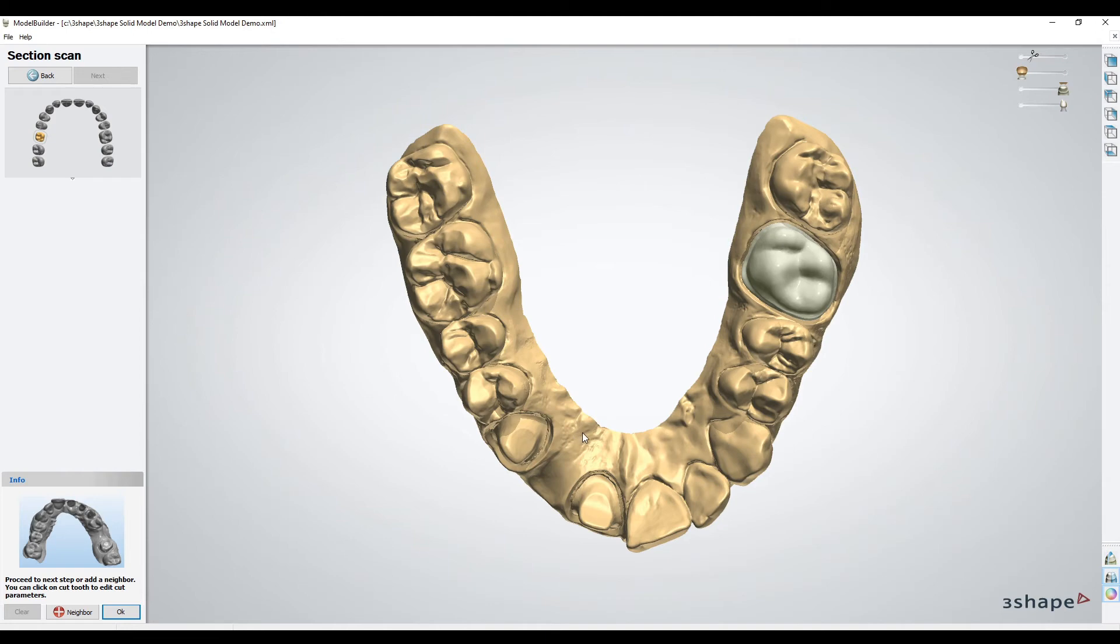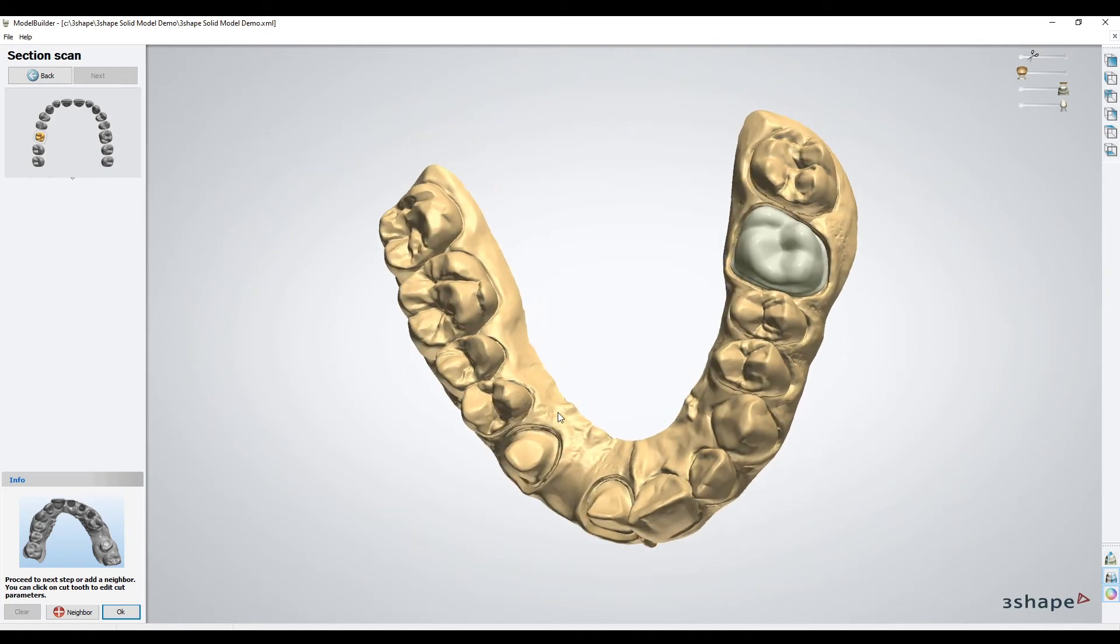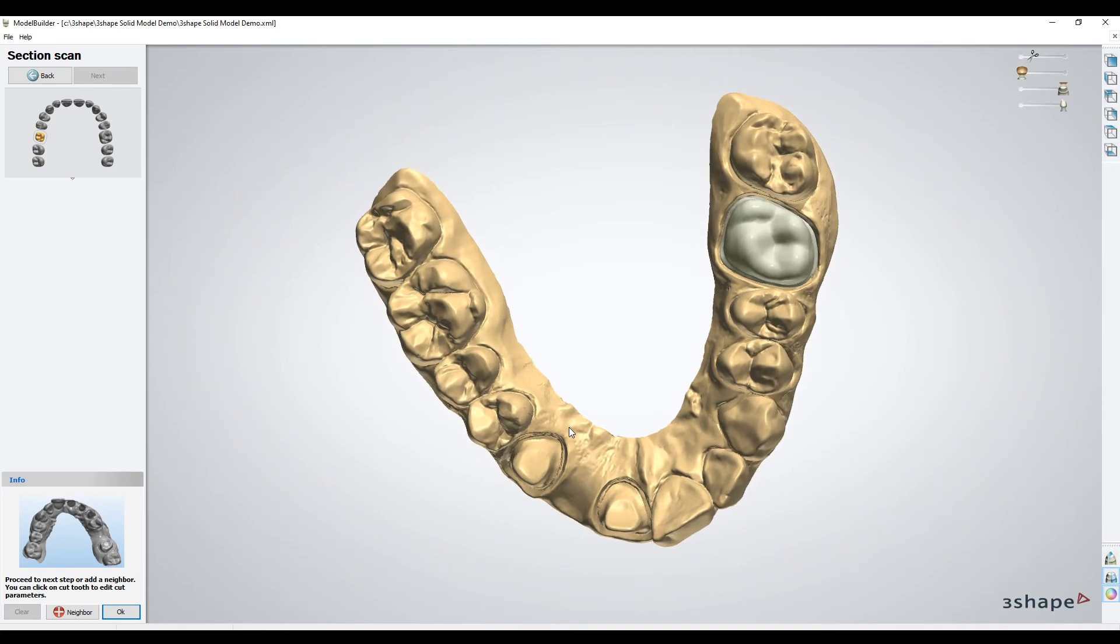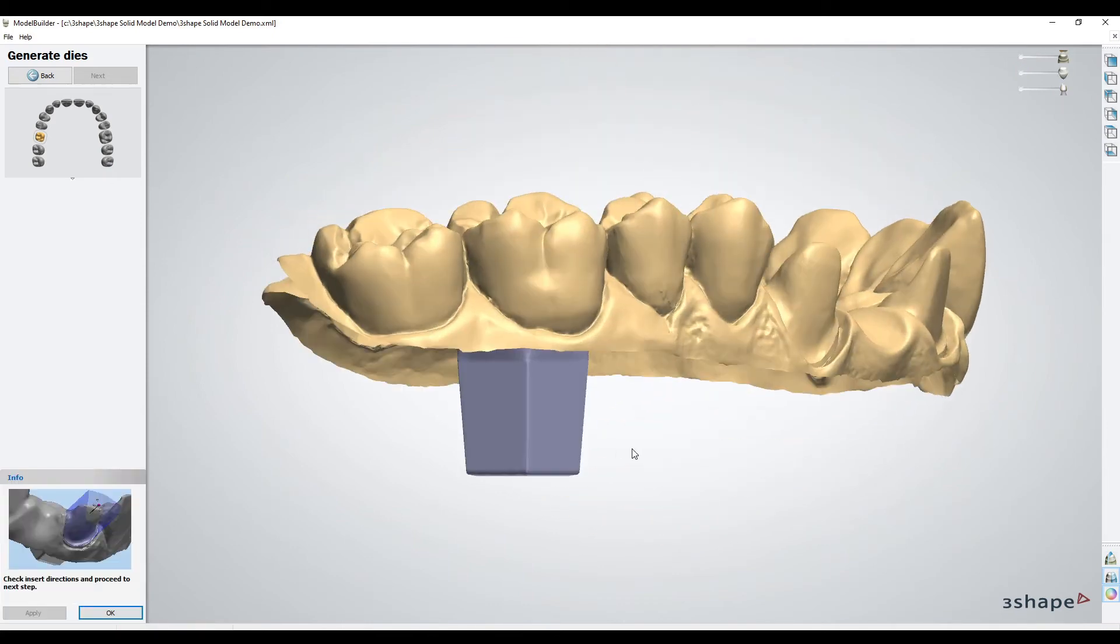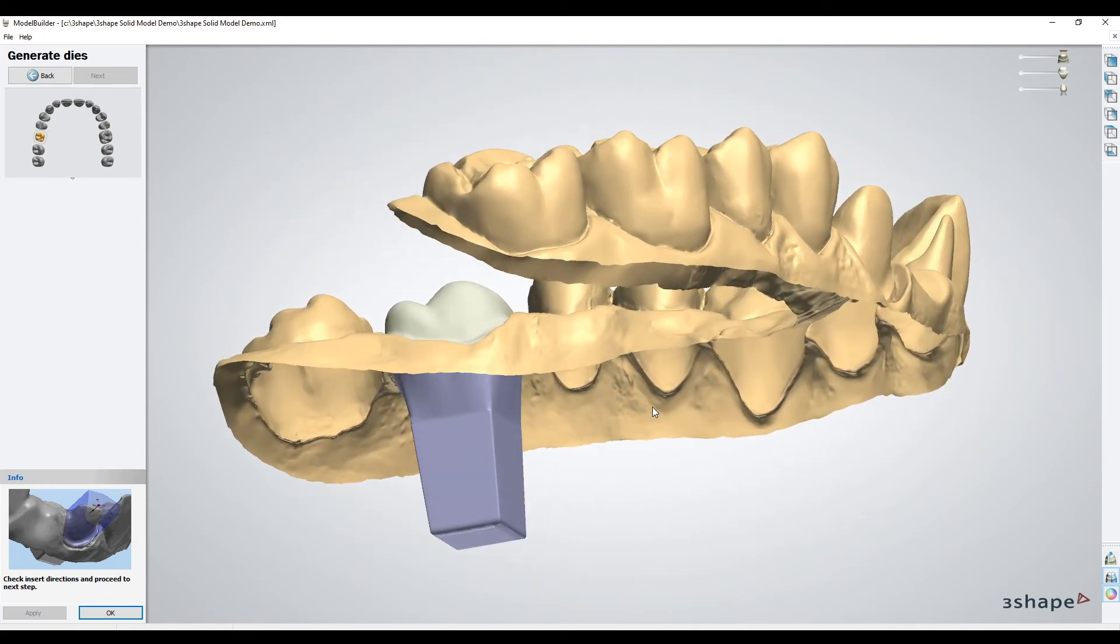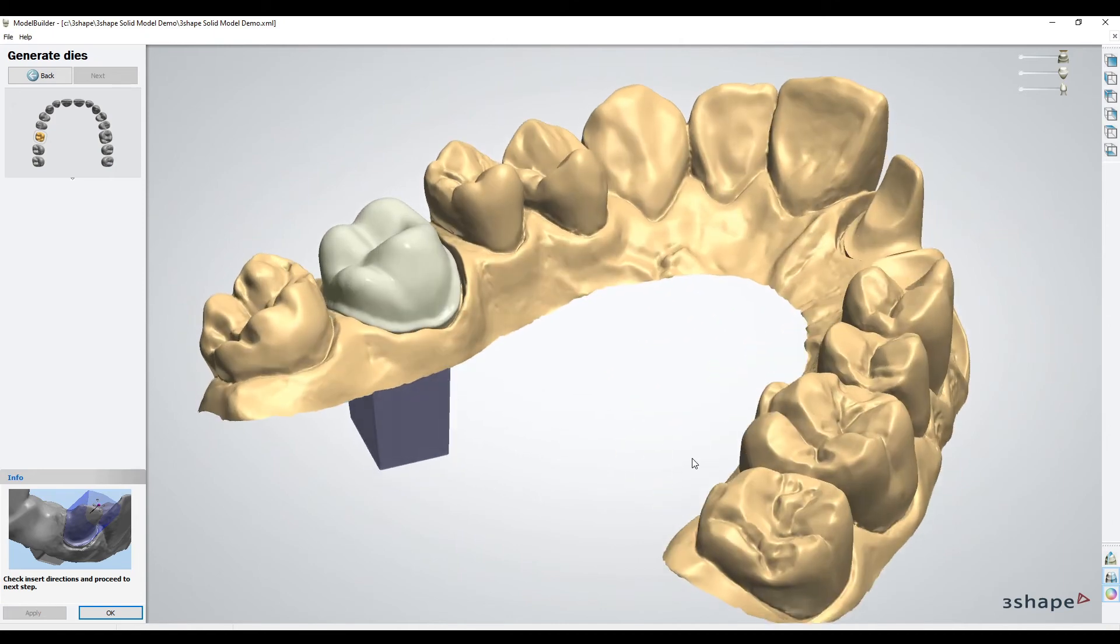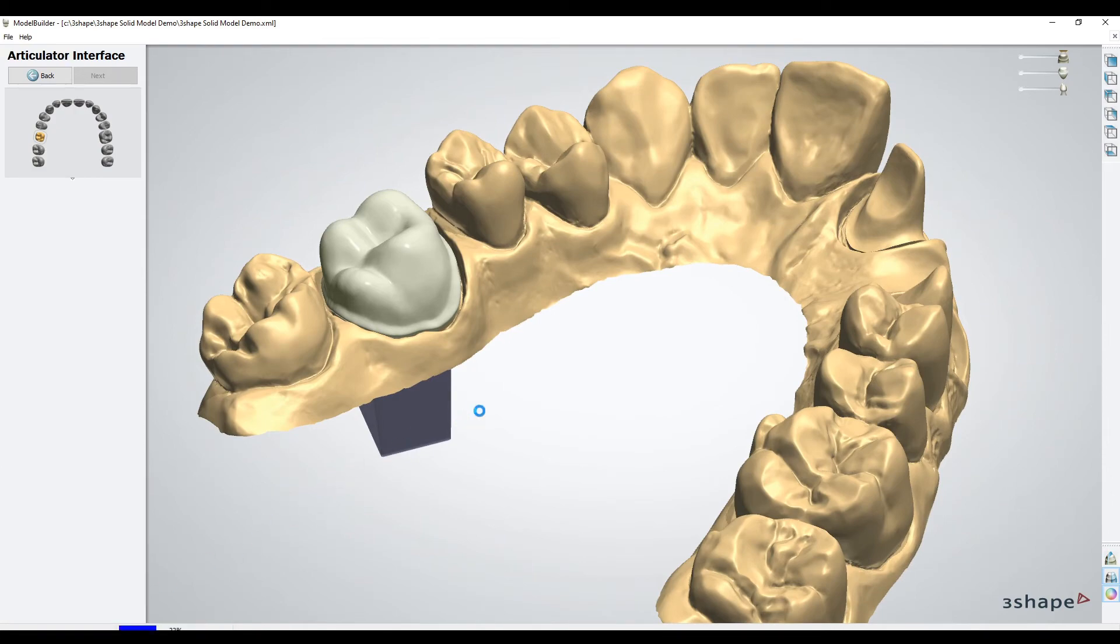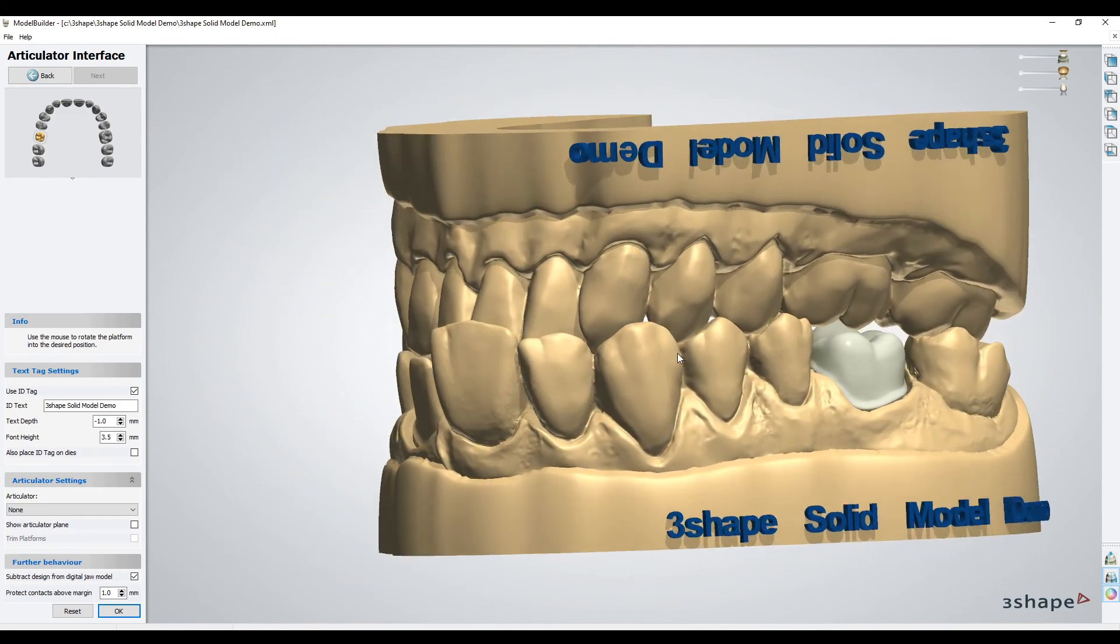This next step, section scan, is only really to make an adjacent tooth removable, so for solid models we don't need this. You can just hit OK through it—nothing to do here. The next step is it generates the die. Even for solid models it's sort of quote-unquote generating a die, but again for solid models doesn't matter here. You don't really have to pay attention to it—just one more reason why solid models are a little bit easier as a workflow, not just in 3D printing but in CAD.